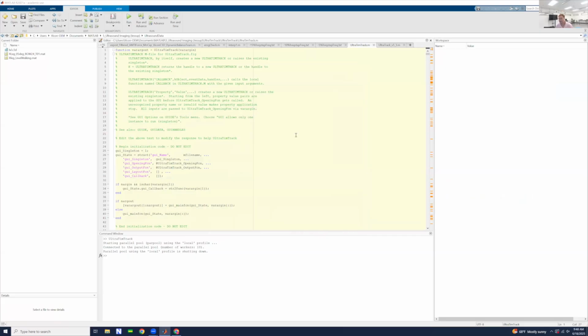I haven't personally, but when I've spoken to Tim about this particular software, it was a really extensive process that he went through involving manual tracking, I believe, at least for this next software that I'm going to show you, which is called UltraTrack, which is just optical flow. We have done those comparisons between the automated methods and the manual methods, and it's really solid. So you should be confident in what the measures are giving you.